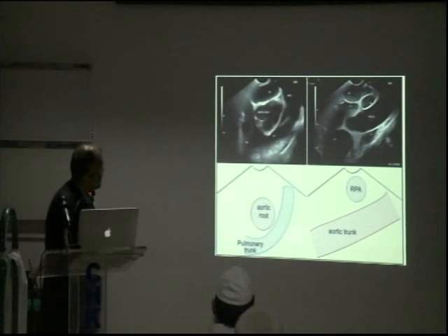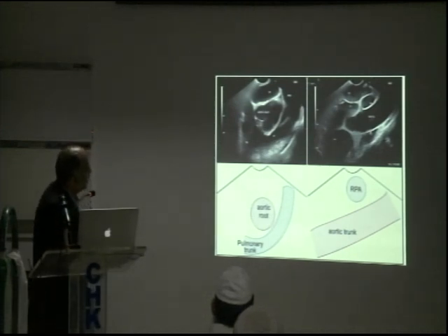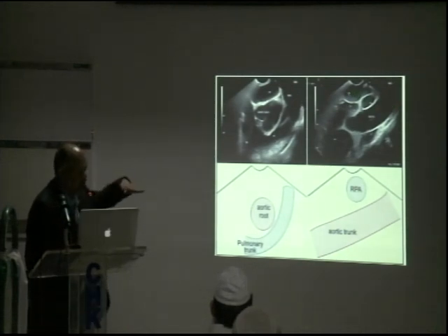Right. So here it is. Now the patient is lying horizontal like this, and so the arch of the aorta will come like this. This is the ascending aorta, and this is the arch of the aorta here. You have the pulmonary artery here. So now it would probably make sense if the patient is lying horizontally.